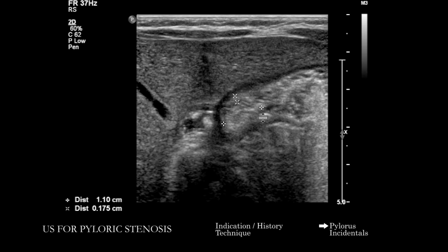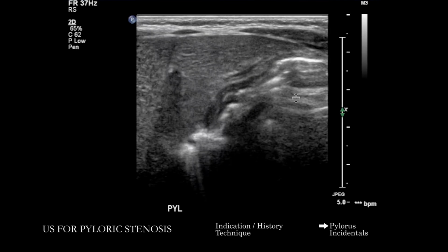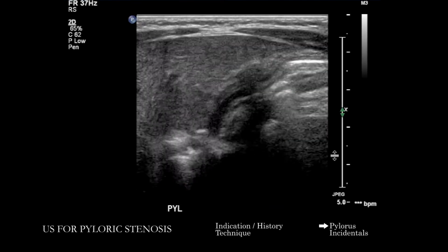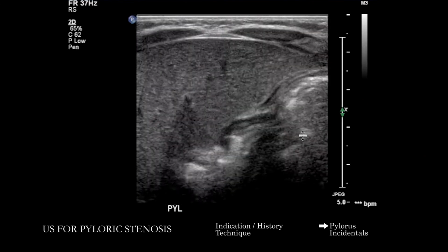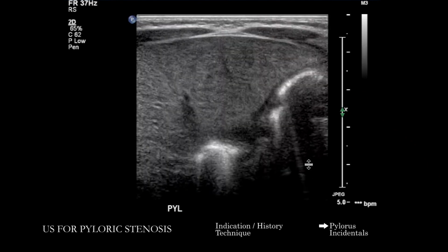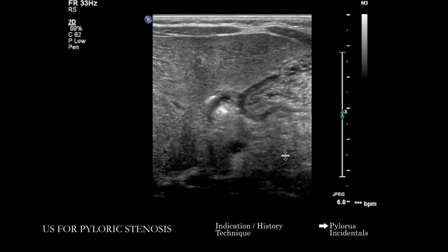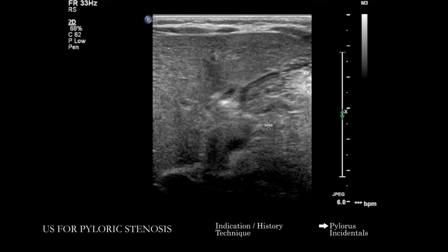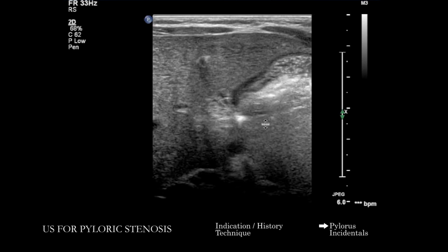And then we've got multiples. And those are just the static images. You can note where the stomach goes here. We do have some cines here, and this is something you want to be looking at in real time. But this is something that we recapitulate on these images: if there is a concern for pyloric stenosis, you want to see, are you actually able to visualize stomach contents passing through the pylorus? I think on some of these later images, we have a better view. So we see here, stomach contents making their way through.